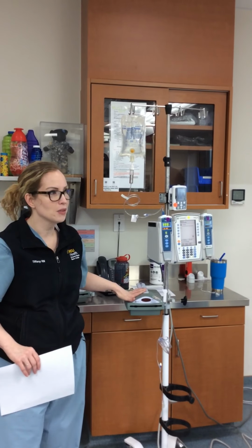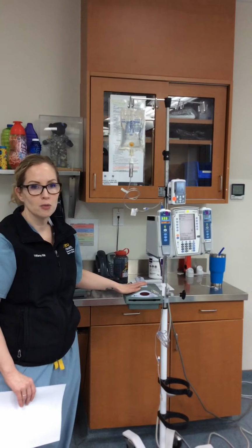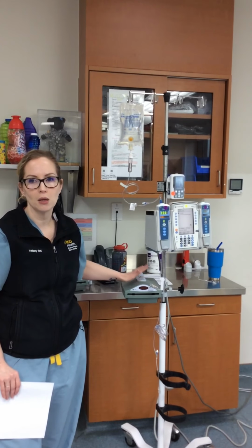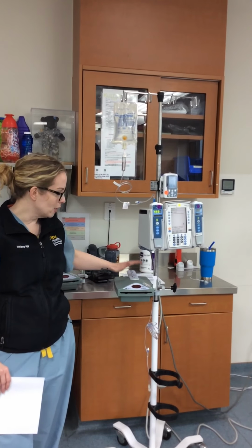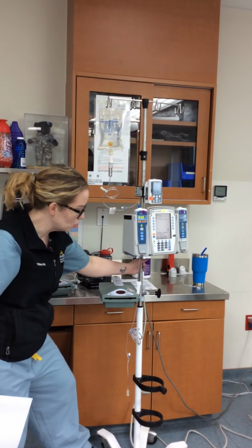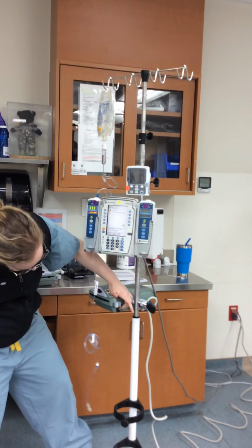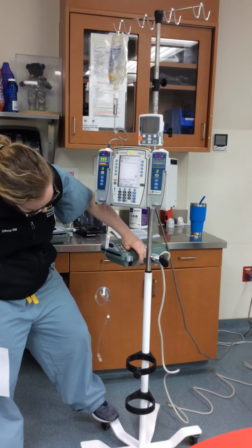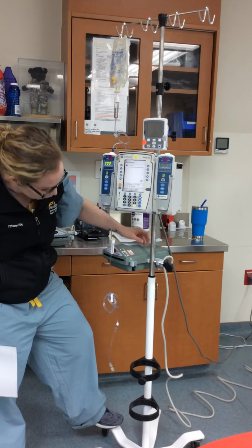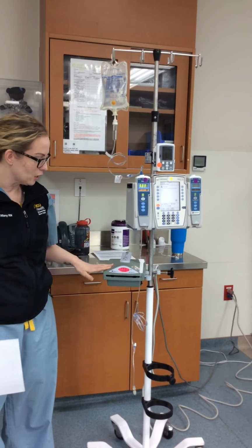So first thing to know about this unit, it must be plugged in to use it. There is no battery reserve on it. If you unplug it, it will turn off. It is a small unit, so super easy to carry and use and hook up. There is a small on-off switch over here underneath this little bubble trap. If you flip that on, once it's plugged in, your fluid warmer is turned on and ready to go.